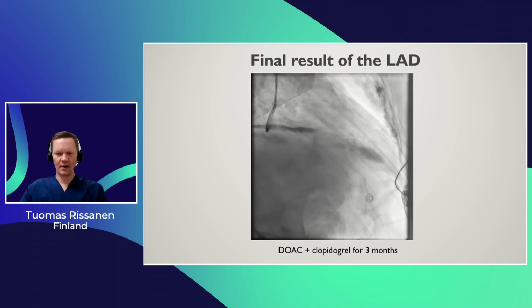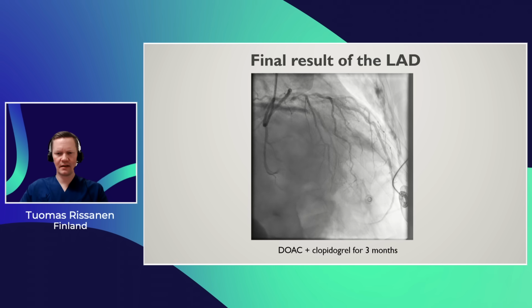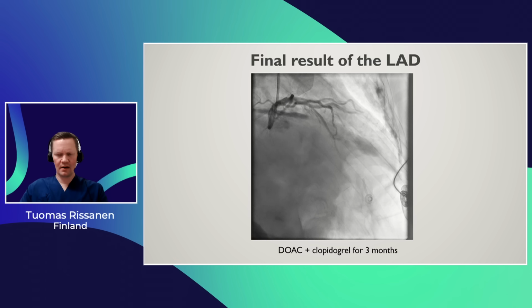And this is the final result. You can see that the flow is good. I think the flow was already a little bit diminished before we did anything.